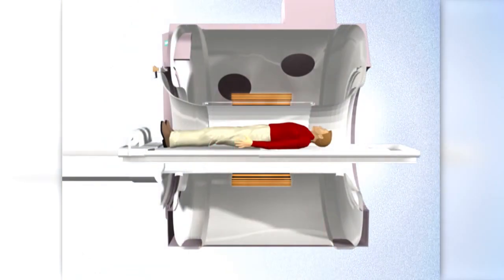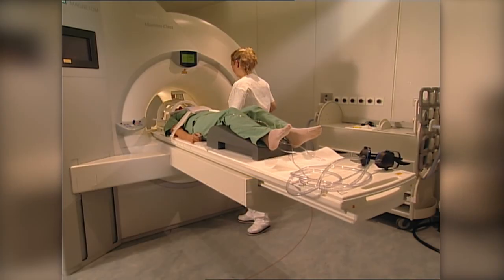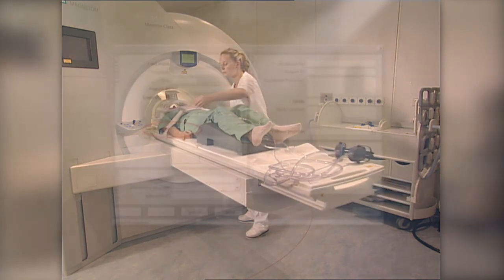The high-frequency alternating fields used for stimulating the magnetic resonance in magnetic resonance imaging are absorbed by the body and cause the irradiated body region to warm up slightly. For safety reasons, control circuits in the MR imager prevent the energy absorbed by the body, SAR, from exceeding a predetermined limit.